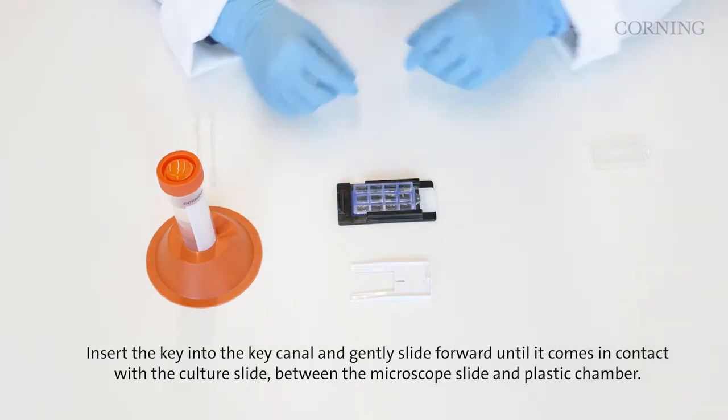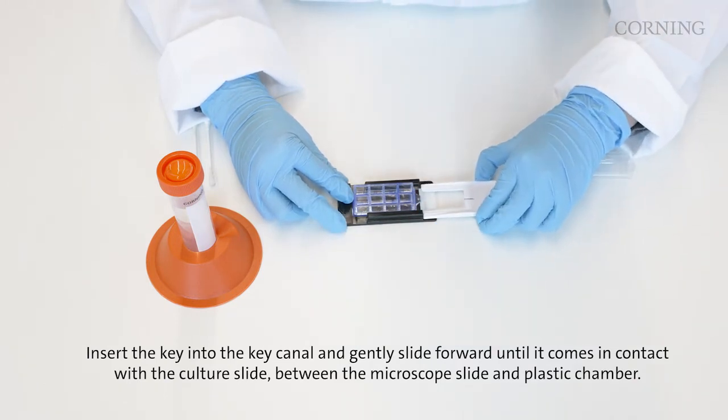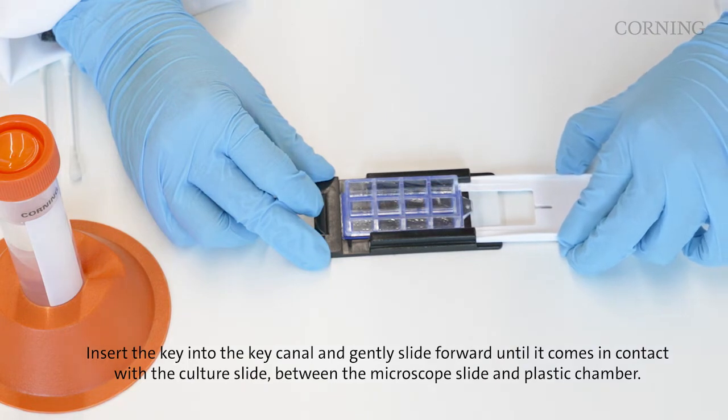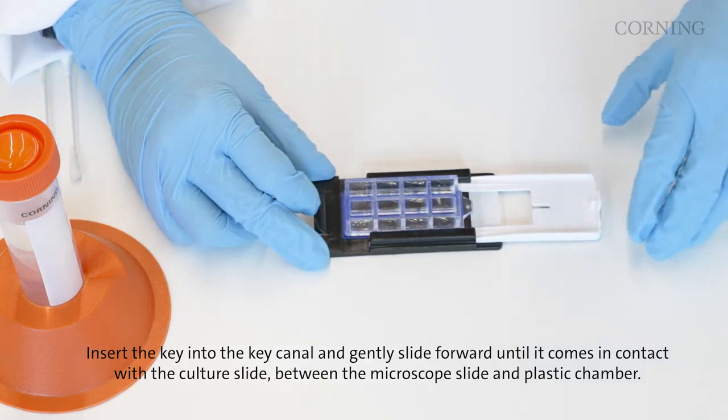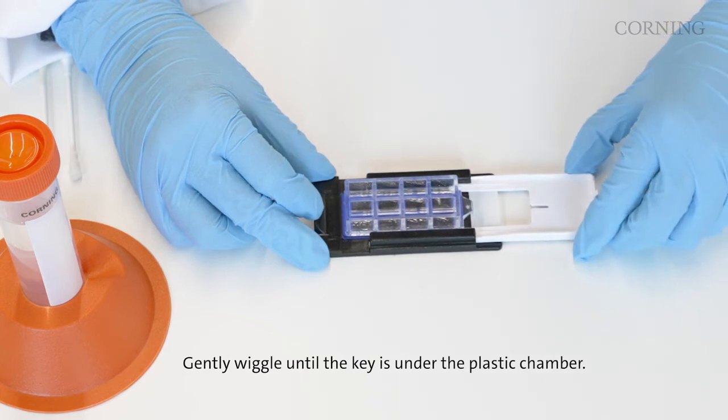Insert the key into the key canal and gently slide forward until it meets the culture slide between the microscope slide and the plastic chamber. Gently wiggle until the key is under the plastic chamber.